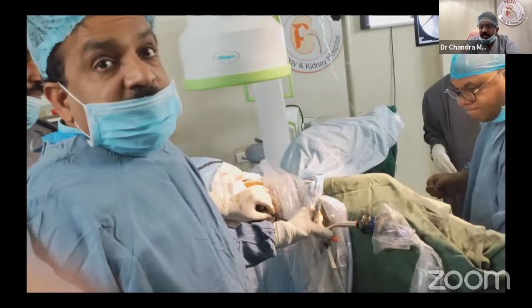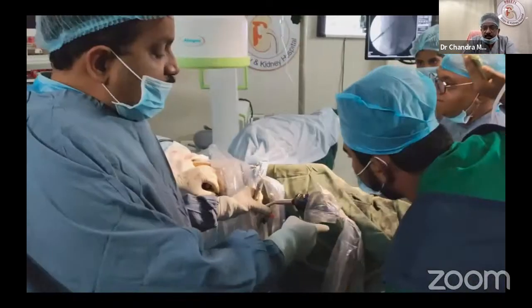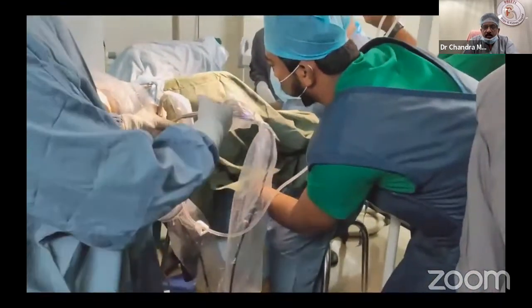You can shift it a little adducted. In fact, if you want to do only supine PCNL, the leg can be kept straight. If you want to do both RIRS and supine PCNL, it has to be a little low and flexed. Here, purposefully, the technician is moving the leg. I am showing how it is adducted, and then you can go to the upper calyx. So he is changing the position, like that.